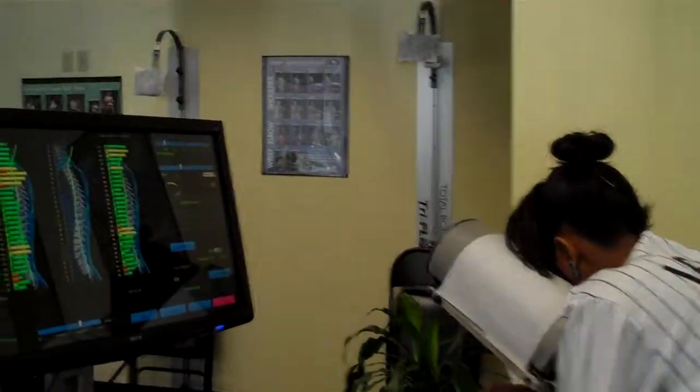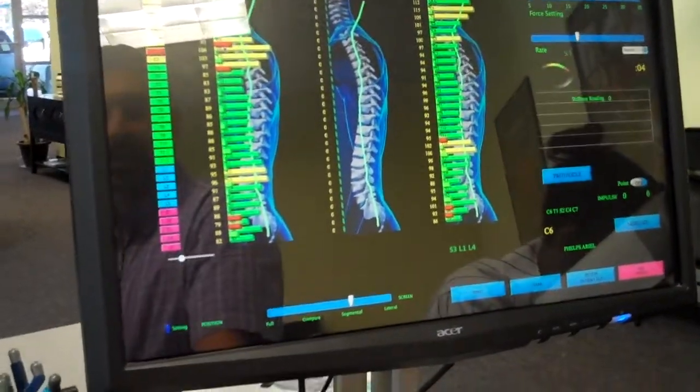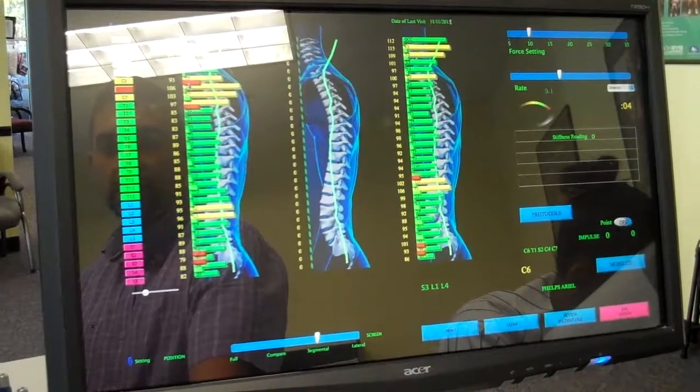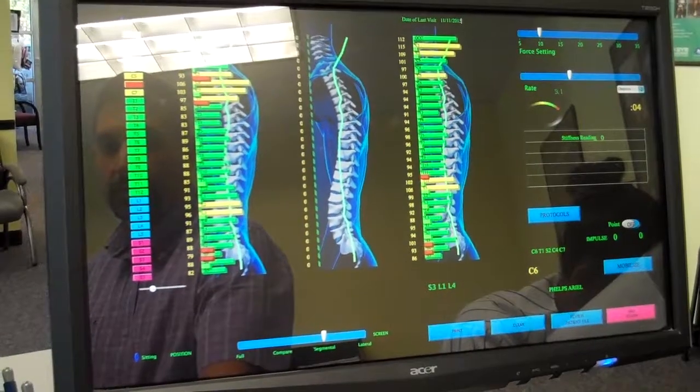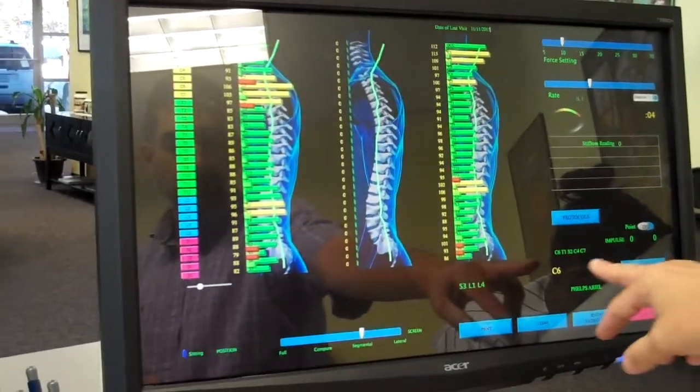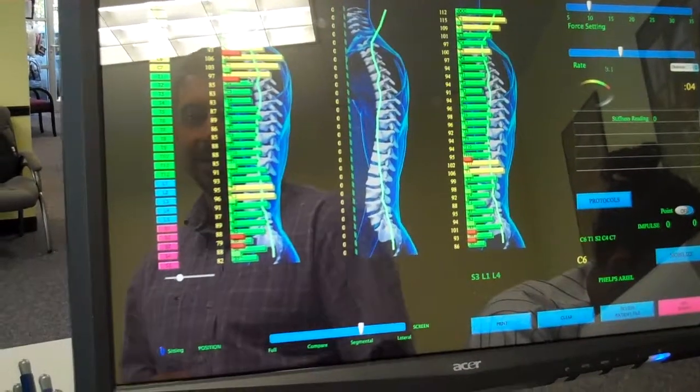Now if we look at the Polestar screen, one thing to keep in mind is that the areas that are flagged in red are the areas that are fixated and need to be adjusted. The areas that are flagged in yellow are surrounding muscle tension. So what we're going to do is utilize the smart intelligence of the ProAdjuster where it's already pre-picked the areas that need to be adjusted.